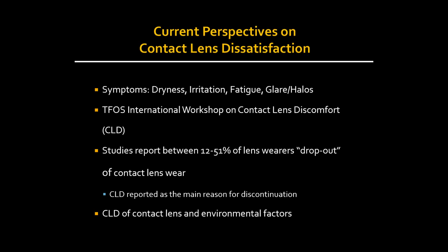I mean, if we look at some of the facts, we can all probably attest to the fact that we have had that patient that's in our chair. They have symptoms of dryness, they're irritated with their contact lenses, they may feel fatigued at a certain point, they have complaints of glare and halo. This is not new, and it can be frustrating for us as practitioners, and we want to help our patients out.